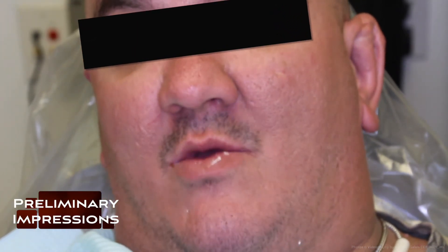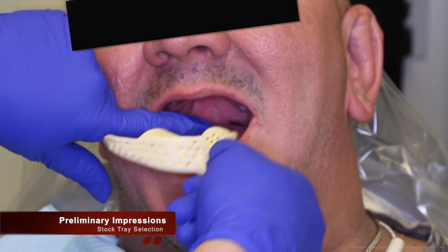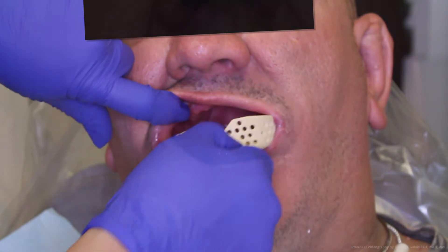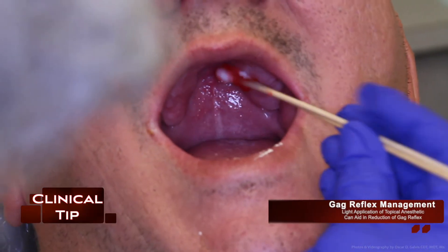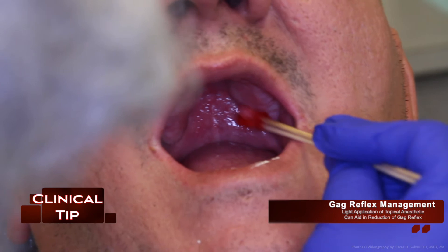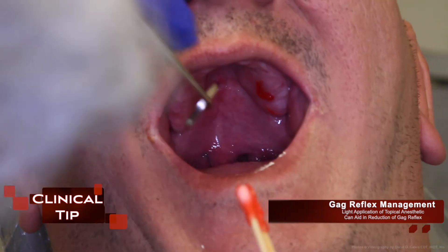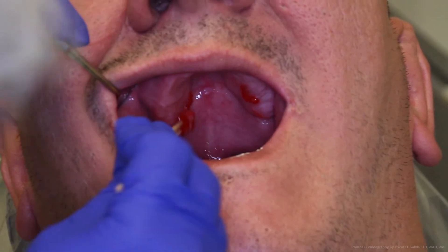Once the clinician has given the green light to the fabrication of new complete dentures, the first step is preliminary impressions. A clinician or dentist will select a proper size stock tray for the preliminary impression. Here's a clinical tip: for patients with major gag reflexes, topical anesthetic can be used on the palate and it can aid in reducing the gag reflex.